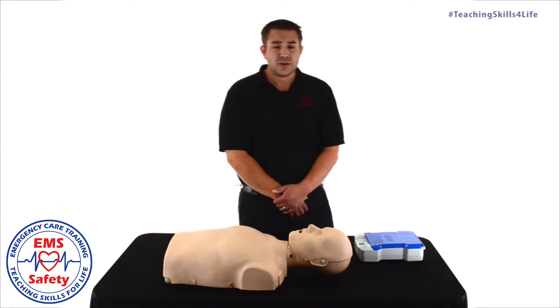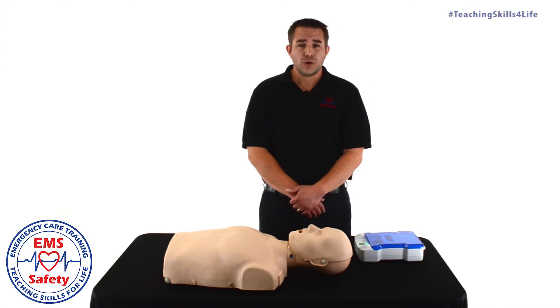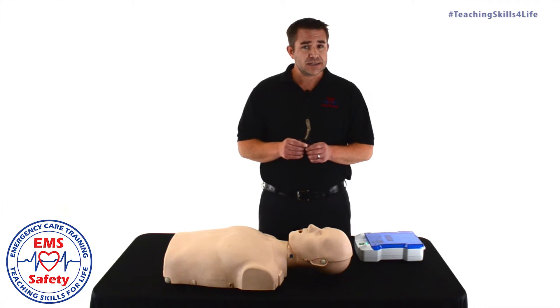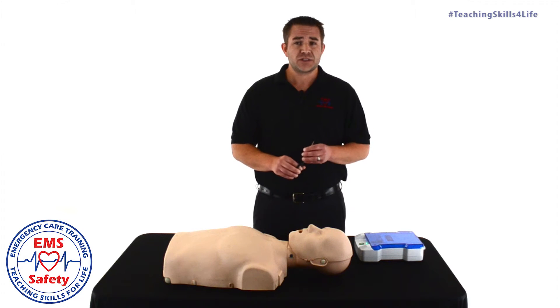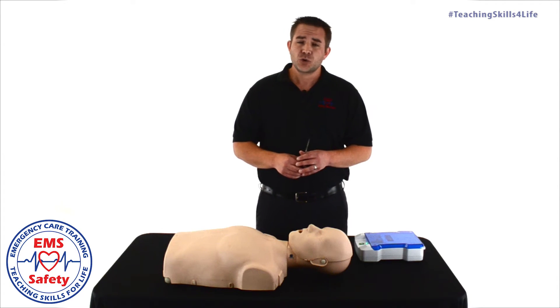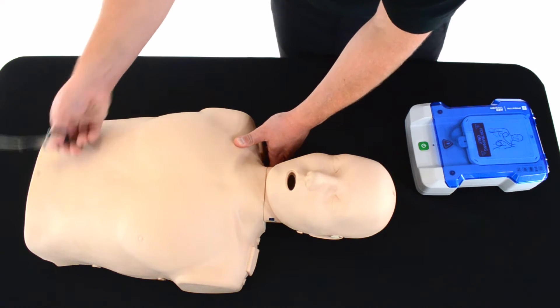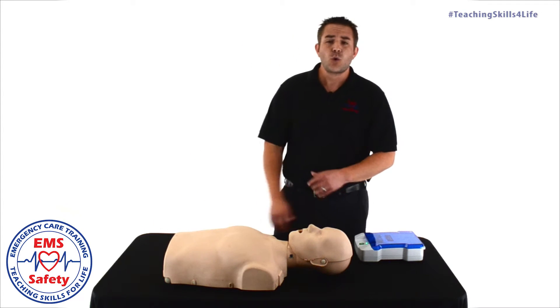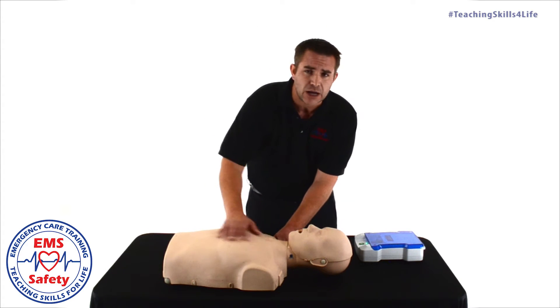We have been directed to apply those pads to the patient's bare skin. If this victim is wearing a shirt or a bra, we're going to need to remove that. The best way to do so would be with EMT shears — that's going to be the quickest and easiest. Ideally, there will be another trained rescuer already performing CPR on this victim. We don't want to interrupt that CPR, so we're going to work around them to remove that clothing. It is quite possible that this victim was sweating profusely prior to having sudden cardiac arrest, so we're going to need to make sure we have a dry surface for those pads — we'll just give them a quick towel off.